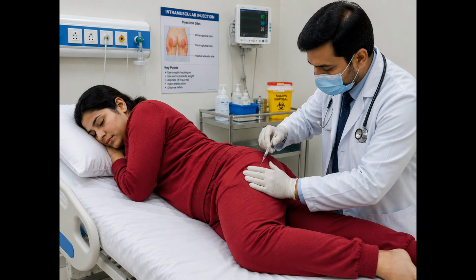Every successful IM injection begins with careful preparation. Before administering any medication, the healthcare professional reviews the physician's prescription and verifies the patient's identity using approved identification methods. The medication name, prescribed dose, route of administration, expiration date, and documented allergies are checked carefully. These safety measures help reduce medication errors and ensure that the correct treatment is provided.